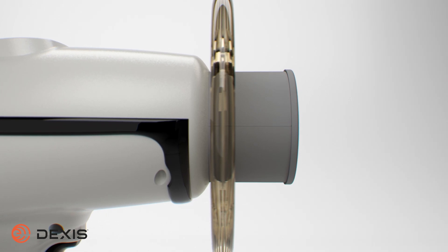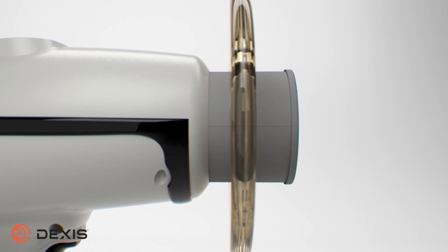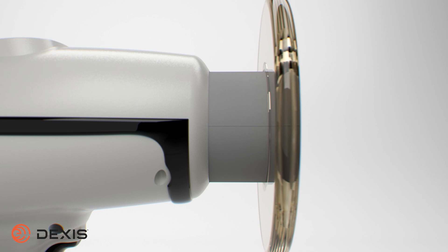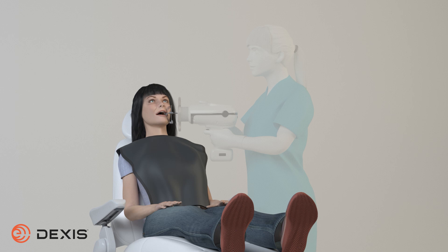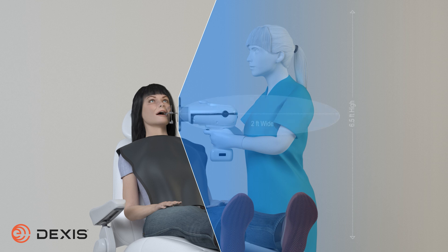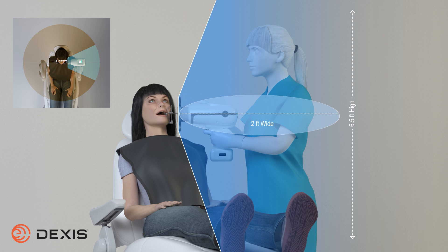The backscatter shield is adjustable and can slide along the collimator. For safety, the shield is permanently affixed and cannot be removed. When held properly, the backscatter shield provides an effective protective zone in which the operator can safely stand while operating the Nomad. The protective zone for the Nomad is 6.5 feet high by 2 feet wide. The operator must remain in the protective zone as much as possible to receive the maximum benefit of the protective zone.